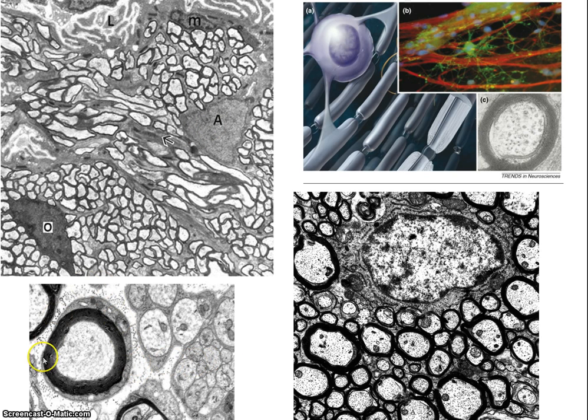We don't have the case like in the peripheral nervous system and the nerves, where we have the endoneurium, collagen, the classical types of connective tissue, the extracellular matrix that you might be thinking about. Not quite so classic, special for peripheral nerves, but this also is reminding us that here's a bundle of axons that are surrounded by an oligo, a Schwann cell in the PNS, but an oligo in the CNS for unmyelinated axons, right?